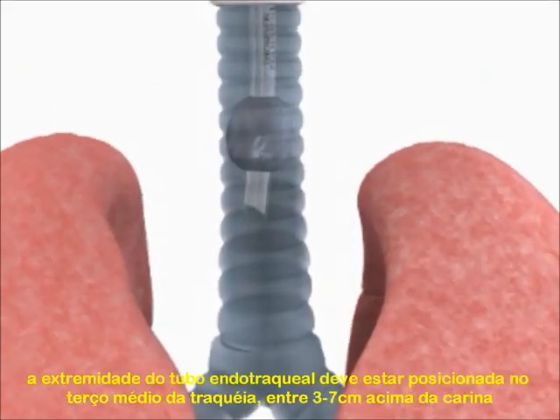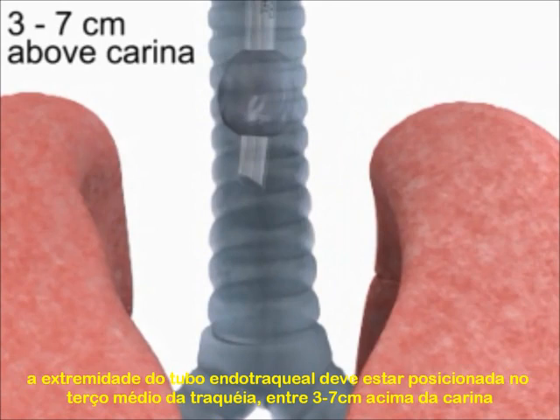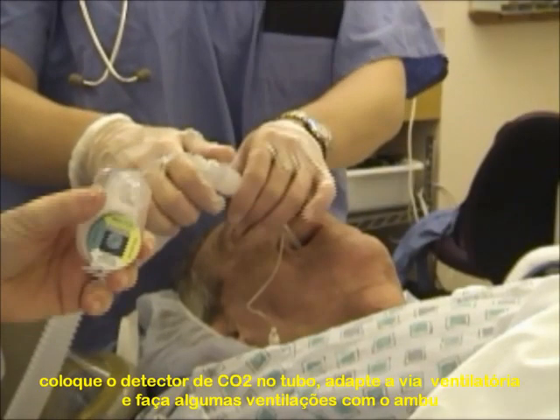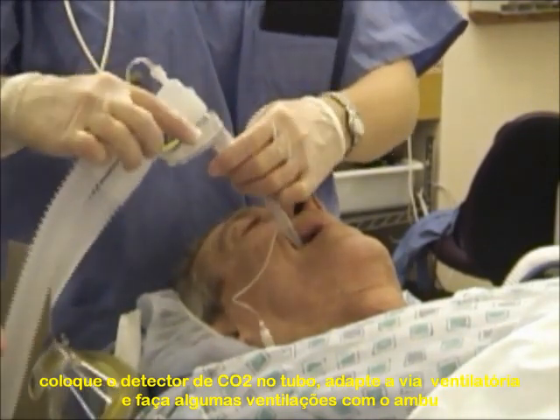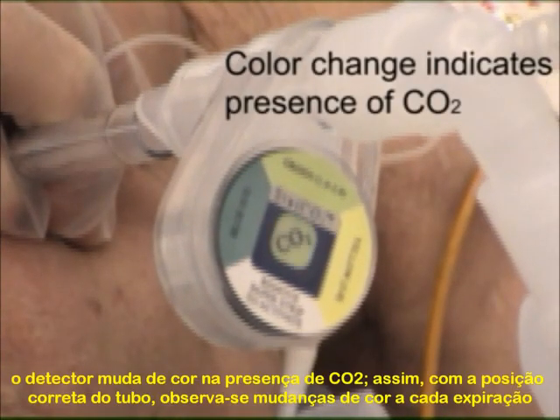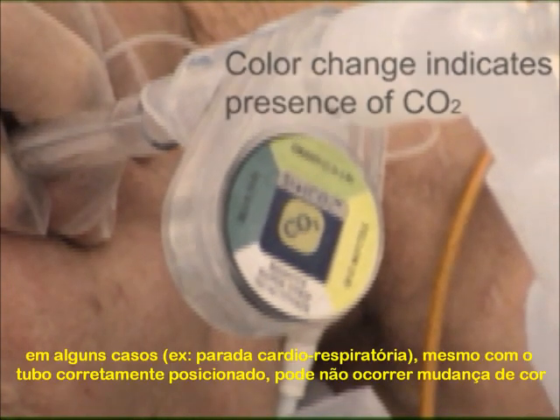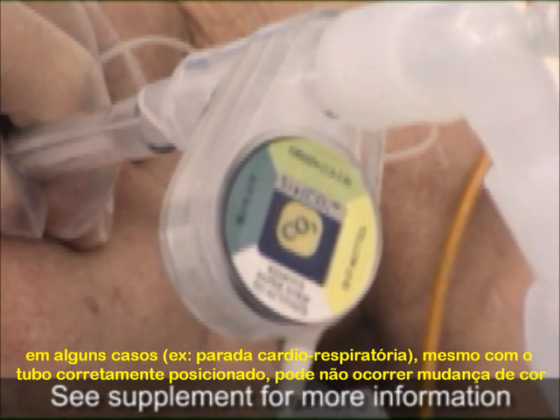The end of the endotracheal tube should lie in the mid-trachea, three to seven centimeters above the carina. A good rule of thumb is 22 centimeters at the teeth for the average size adult. Place the end-tidal CO2 detector onto the endotracheal tube and attach the ventilation bag, administering a few tidal volume breaths. Carbon dioxide will be reliably and consistently detected within the first six breaths of an endotracheal intubation and with each exhalation thereafter, except in some cases of cardiac arrest when gas exchange may not occur.